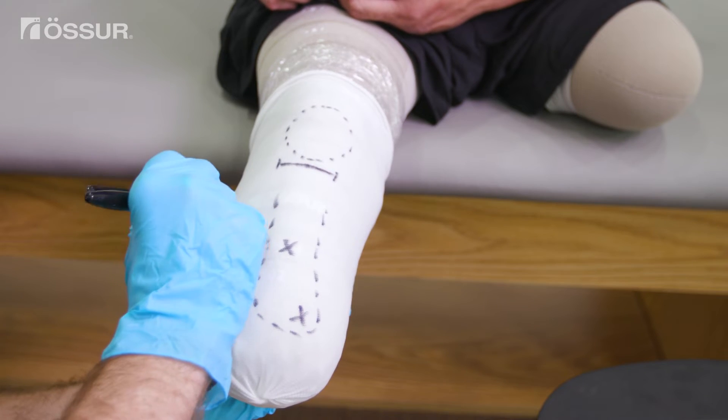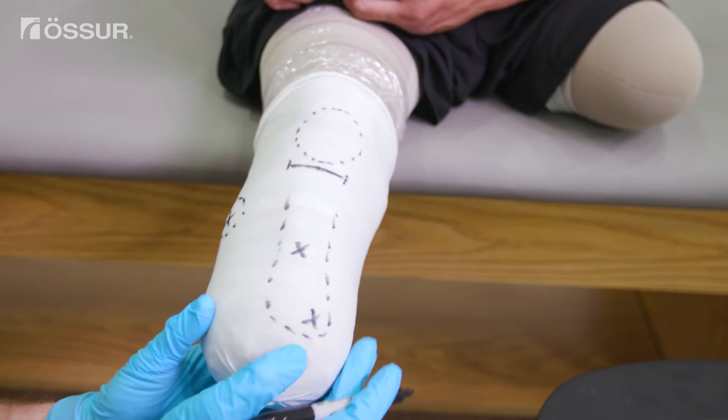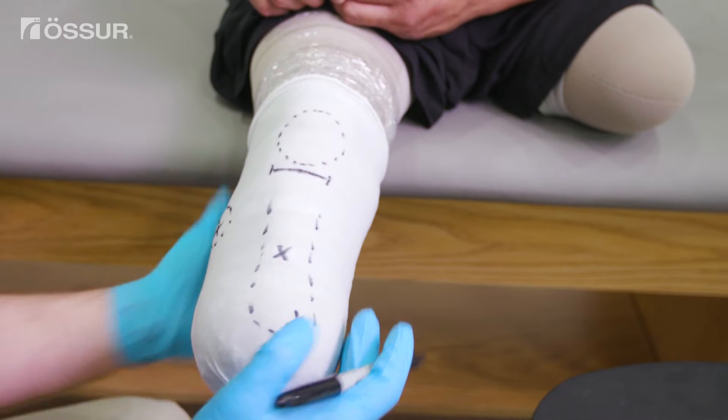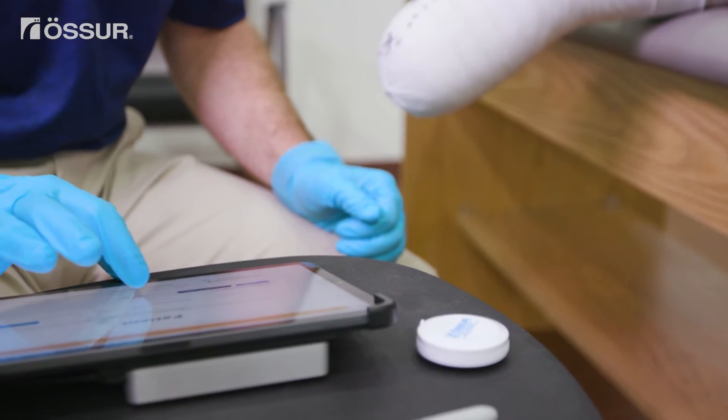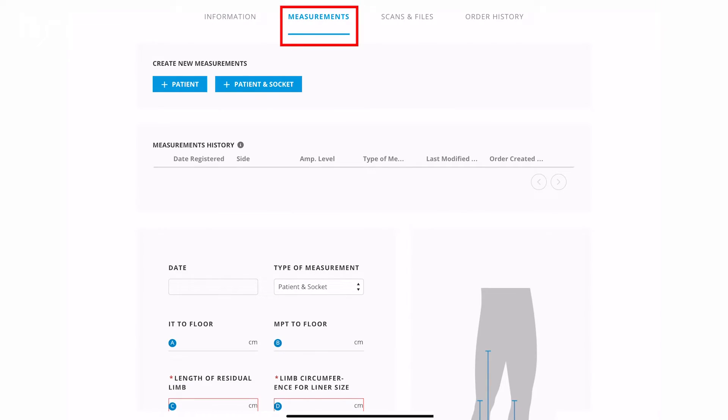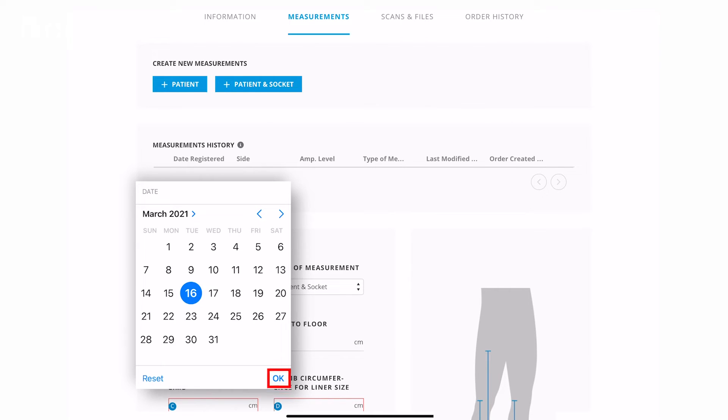The scanning process captures these landmarks for the designer to use during the modification process. To begin, press the measurements tab inside the portal. Then press patient and socket. Next, select the date of measurement and press OK.